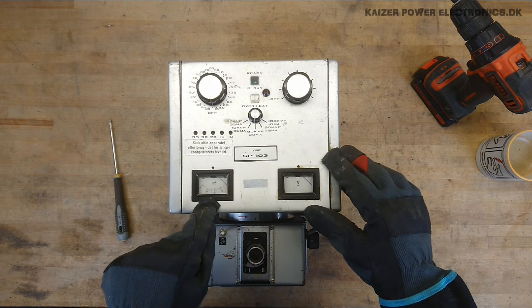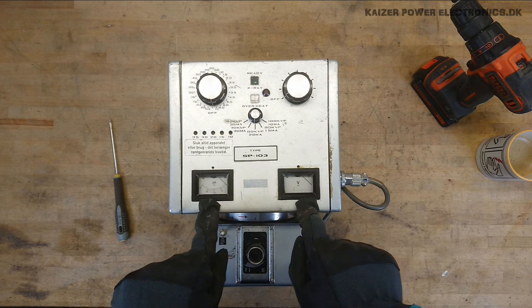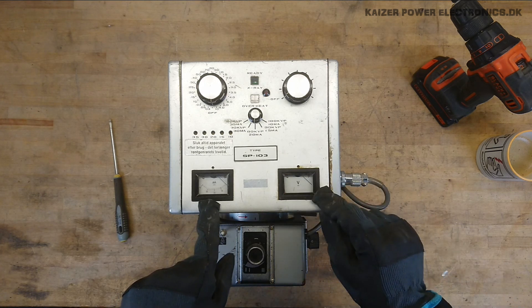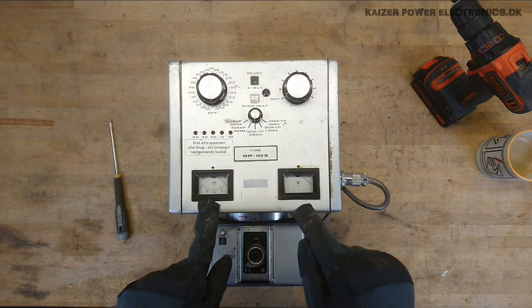There is a meter for milliamps and a meter for alternating voltage, just with a red stripe. Not quite sure what that measures — if that's some kind of over-voltage return from the head.